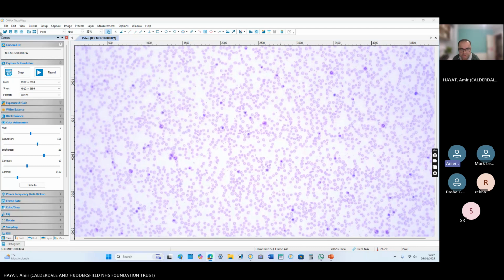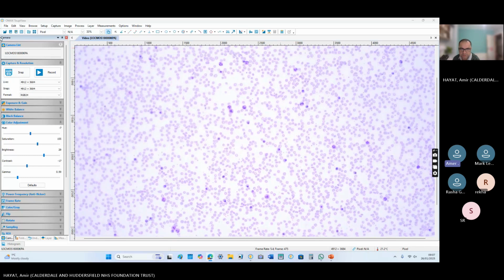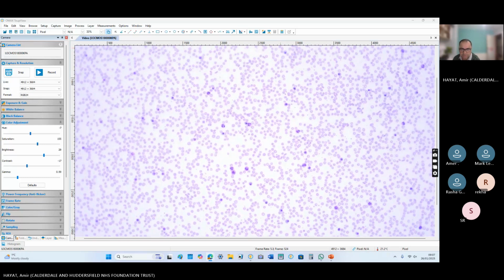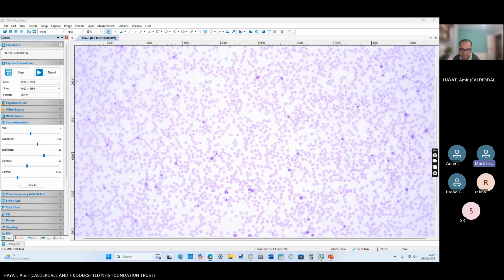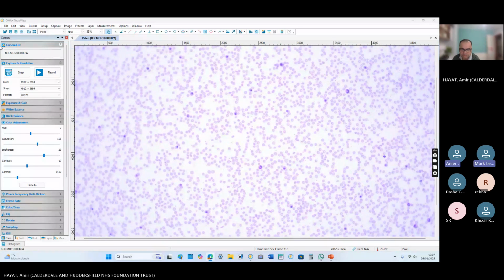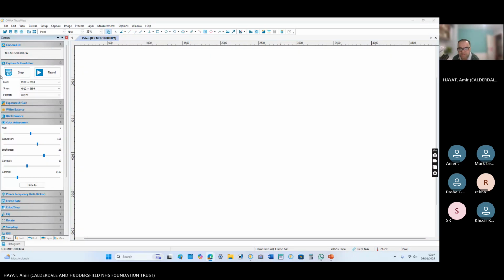You will have one question in the exam which will say list the features or list the findings in the blood film. It will not say to report the blood film. Yeah, there's a lot of nucleated RBCs there. Hemolyzing. So this is power 10. I will go to power 50 to make it clear, and then you list all the findings that are there.